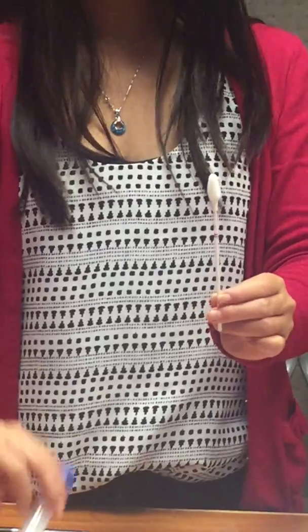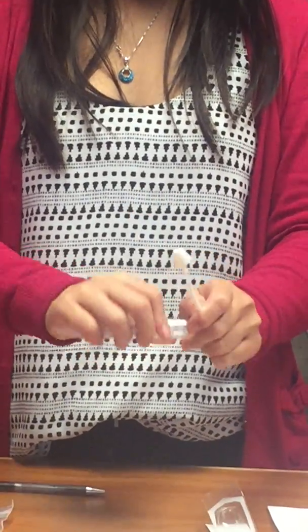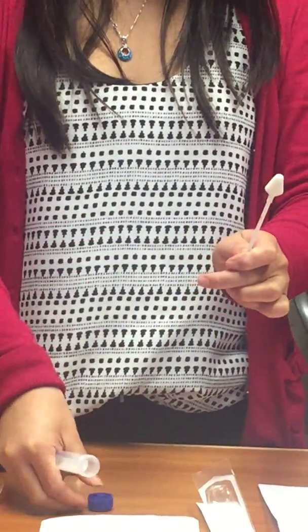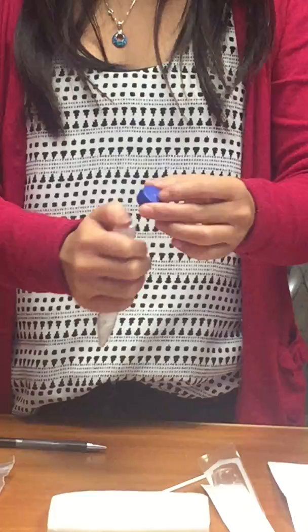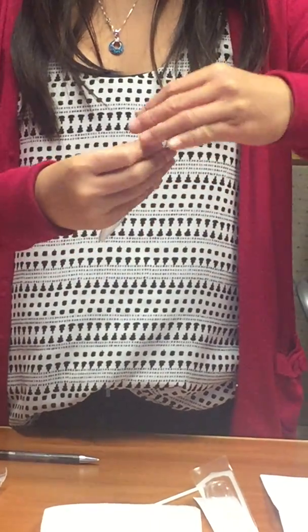Place the swab into the provided collection vial. Break off swab into the vial. Discard the swab handle and wrapper. Close the vial lid securely.